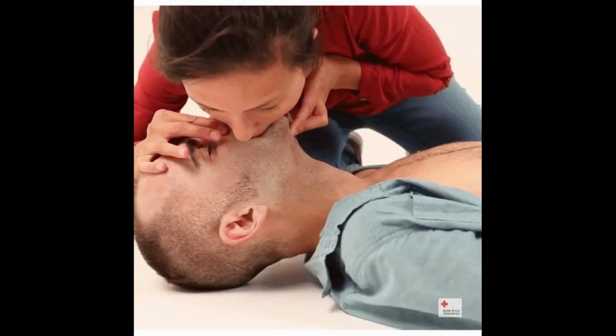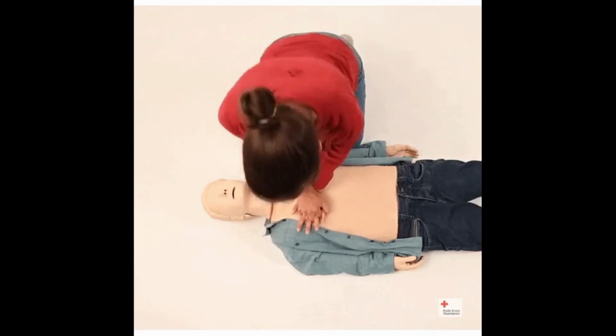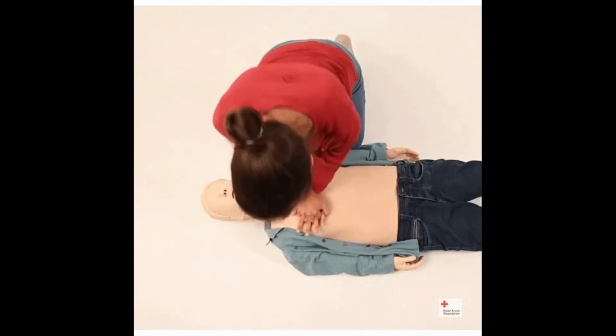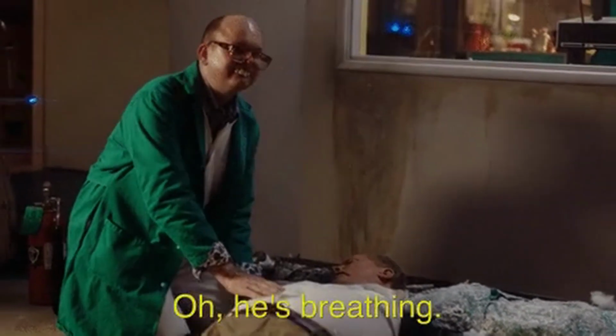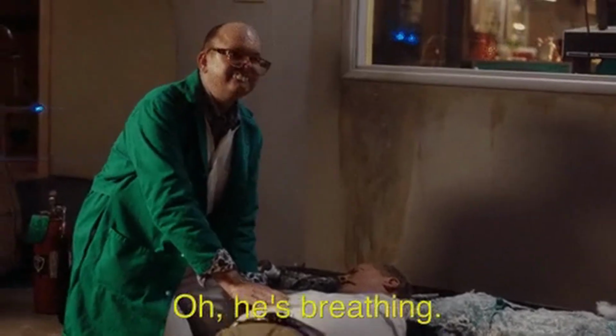7. Continue CPR. Once you have given the victim a shock, you need to continue CPR. You should do it for 2 additional minutes and then let the automated external defibrillator check for a heart rhythm again. Keep this up until emergency services arrive. You should also stop if the victim can breathe on their own or if they regain consciousness. The automated external defibrillator will likely remind you when 2 minutes has passed and tell you to stop CPR.